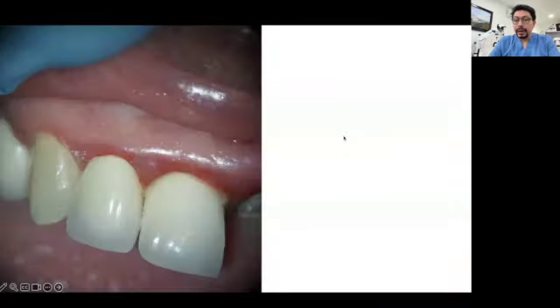in our daily routine. Let's talk about the communication between referrals and the endodontist. This is an interesting case because the referral doctor asked me to do a root canal treatment in the lateral incisor and in the central incisor. And the referral told me, Jenner, you know, we just placed the crowns. The patient is in pain. And please do the root canal treatment on the patient.